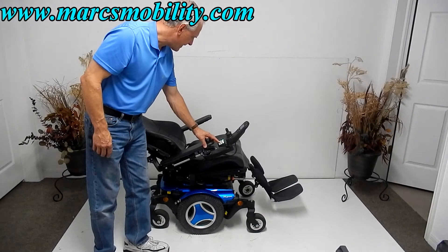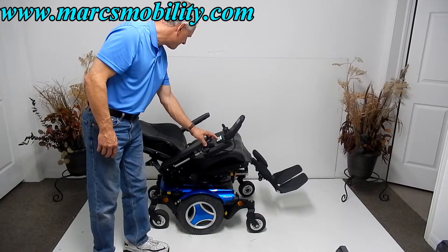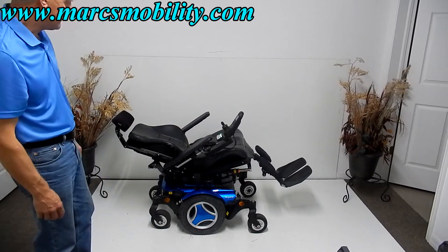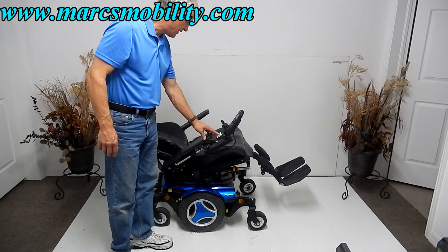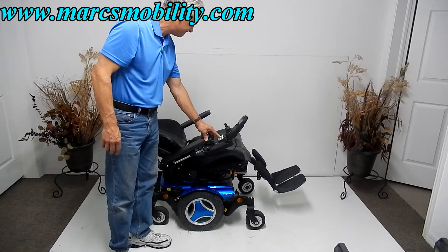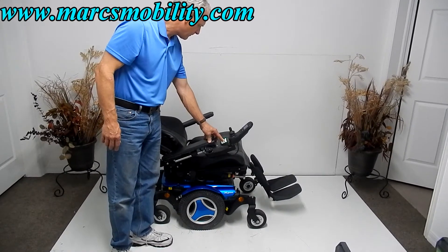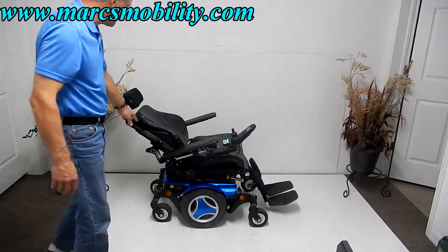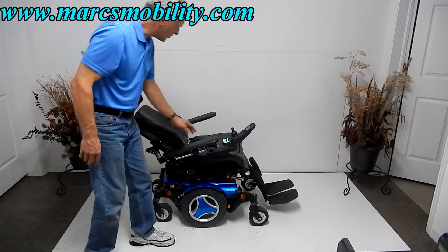You can tilt the seat back also if you wanted to be more laid back. If you wanted to be flat, you would have to tilt the seat back. If you do it only to recline, this would be your recline — so this is considered a partial recline. That's your recline right there.